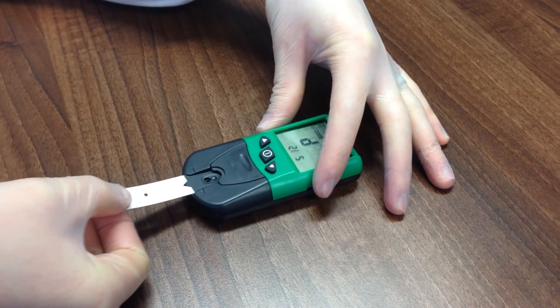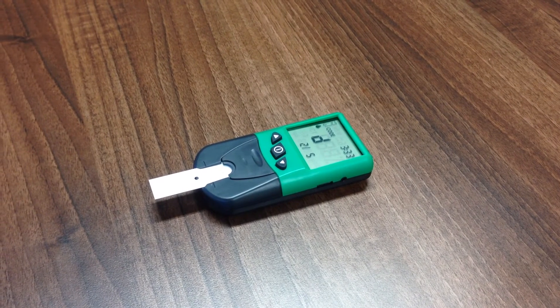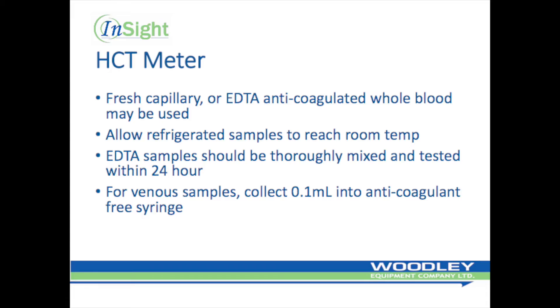Insert the test strip into the strip holder with the notched end in first and the hole facing up. When ready to test the sample, the screen will display a flashing blood drop and the green LED will begin to blink more rapidly. You now have up to two minutes to introduce the blood sample.